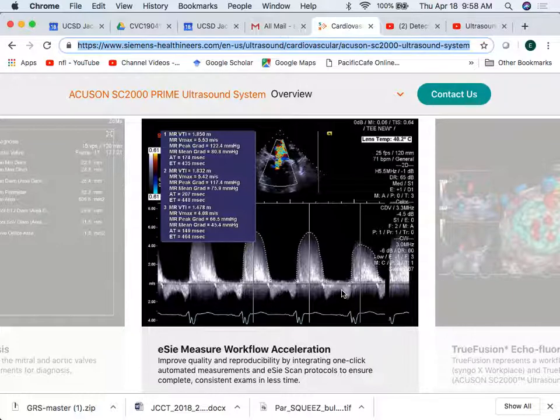waiting for the next heartbeat, and then the atrium contracts. The atrium does a quick contraction and pumps blood into the left ventricle. It's called atrial kick, right? However, the net velocity you see is up, away from the transducer, because again, the valve plane of the ventricle moves up when the atrium does that. So it seems like the net result is a negative velocity, and then it starts to fill, right?